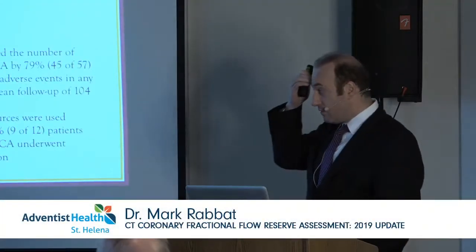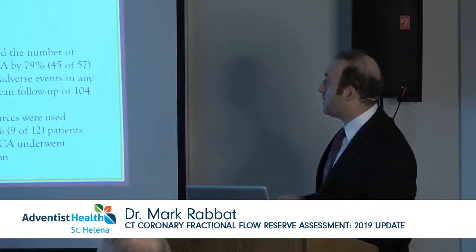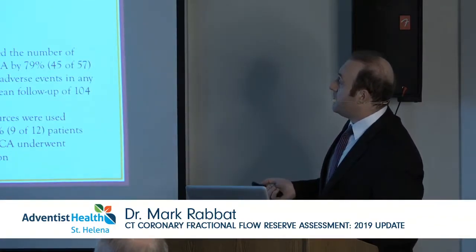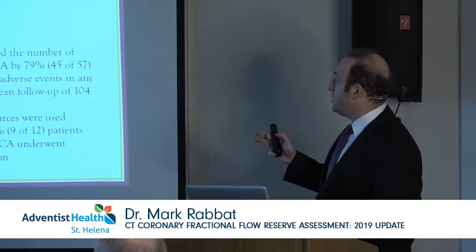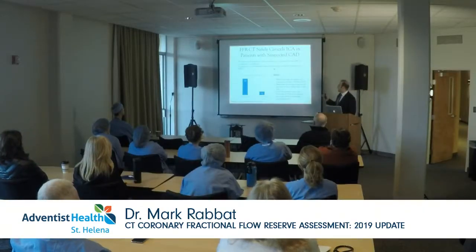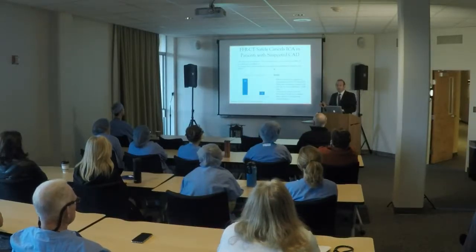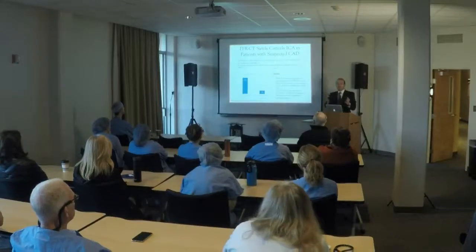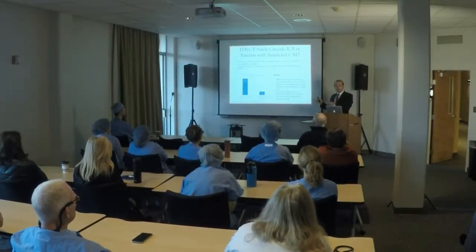This is some of our own data that I presented at the American Heart Association that same year. 138 patients with suspected CAD who were referred for coronary CTA and FFRCT for evaluation of symptoms. Now, not all patients need FFRCT, okay? If the CT is negative, then there's no real value in getting the FFRCT. It's really in those intermediate lesions. So it's really a CTA plus or minus FFRCT guided strategy.